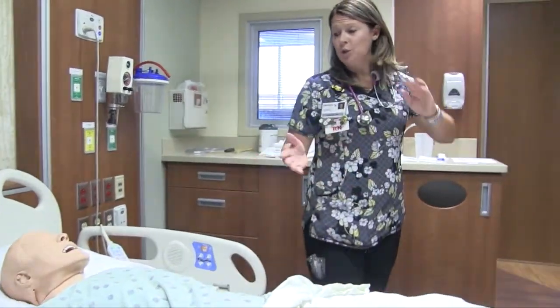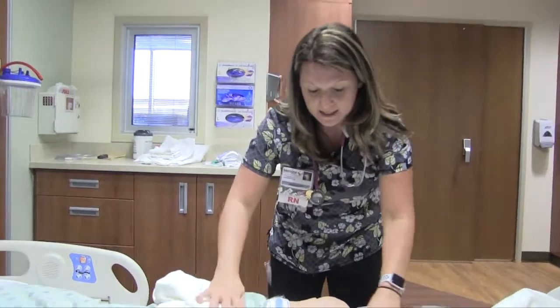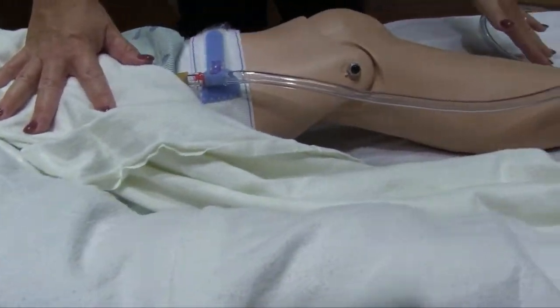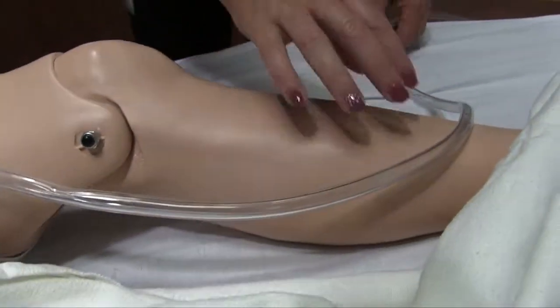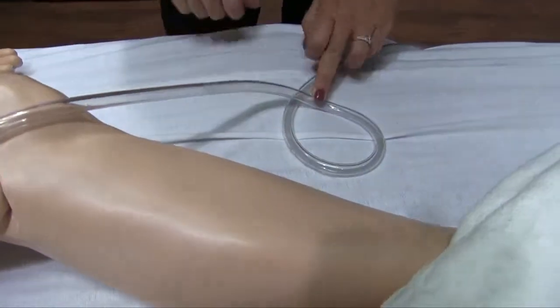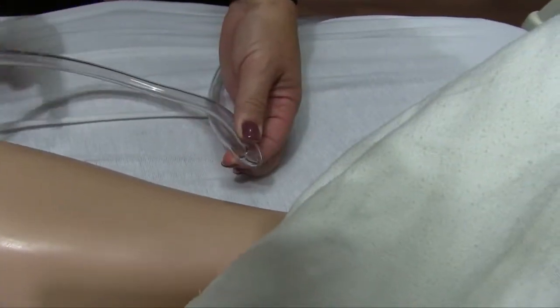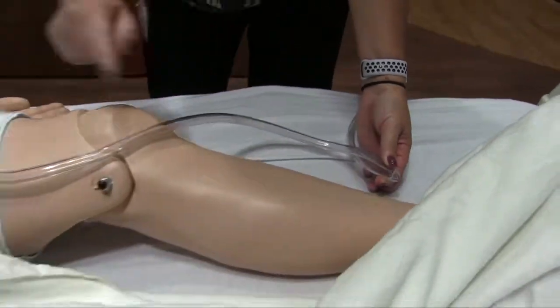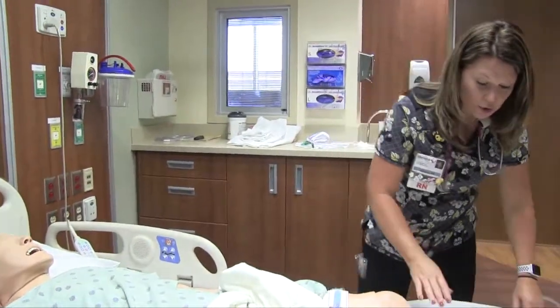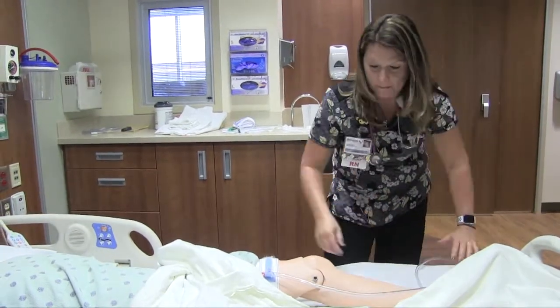Another thing is when you are sitting at home, this tubing needs to be free of kinks. So this needs to be a nice flowing system that does not have any kinks in it. So, you want to make sure if you have excess, you kind of make a loop of it so that there's no urine that's being pinched and backing up into your system. So that's also something that's pretty important and pretty easy to take care of. You can bring it down farther and you can make a loop if you have too much of the actual tubing.